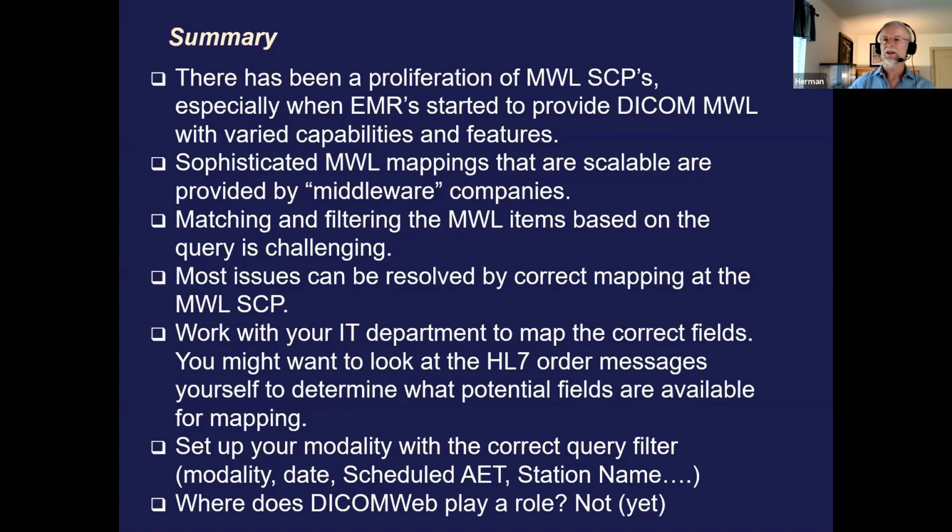There was actually a question. I said, well, what about DICOM web? Well, DICOM web is a way to access DICOM information through web services. And there is actually a worklist implementation for DICOM web.